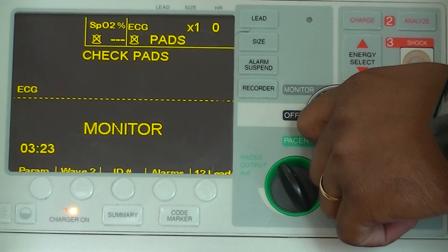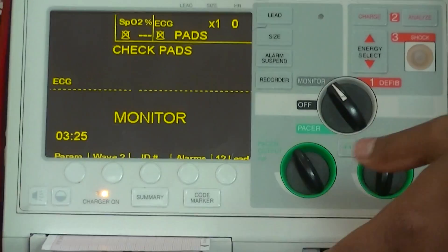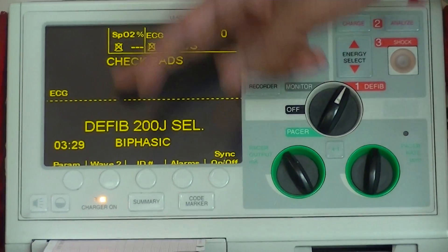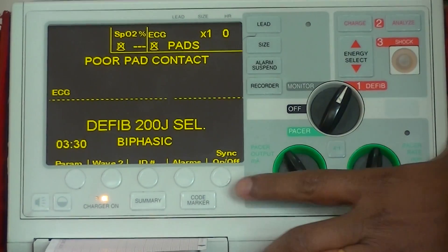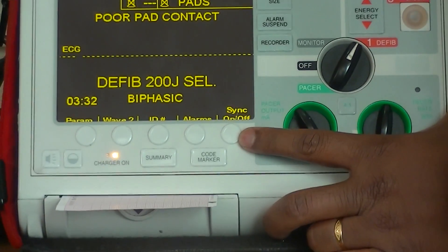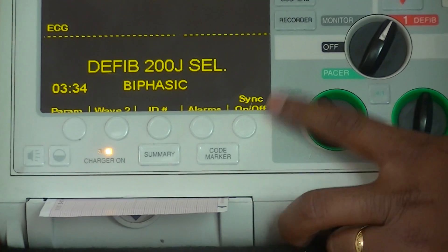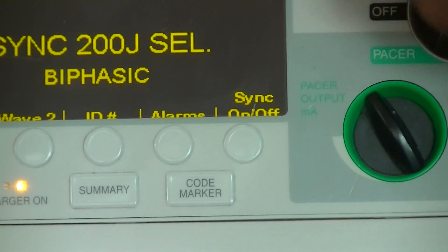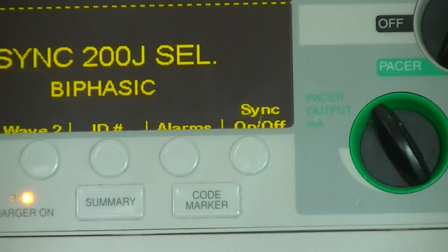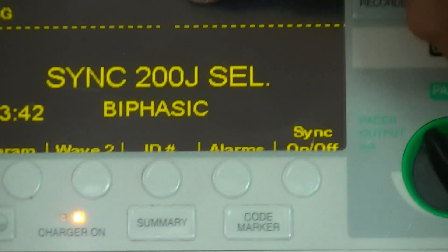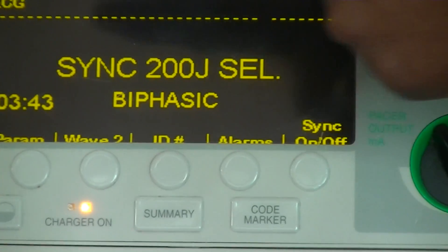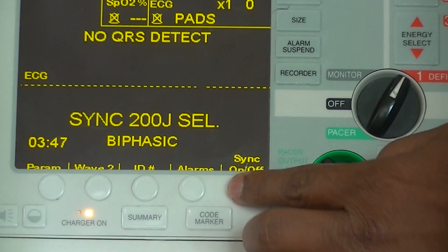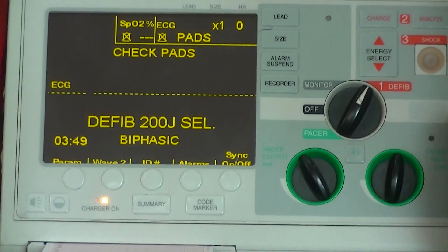Regarding synchronized cardioversion, I can't show you the synchronized cardioversion because I don't have any rhythm on screen. But in this corner, you can see there is a sync button — sync on/off. When you press this, it converts into synchronized mode. Because the monitor is not connected to the patient, you see the dotted lines. Once you switch off and switch on, it will go back to defibrillation mode — asynchronized cardioversion.